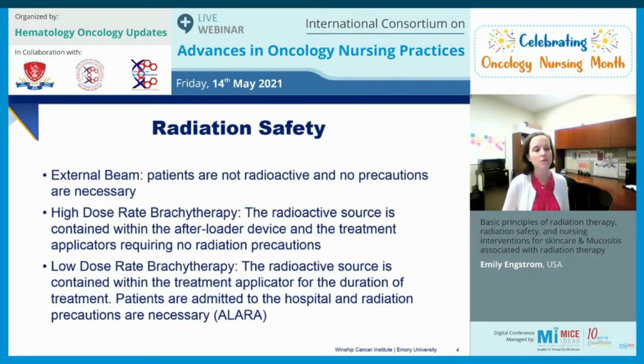And then we also used to use it very commonly for GYN cancers. We would admit our female patients to the hospital, and then place applicators where they needed to be, and then place those radioactive seeds in those applicators. Patient would stay in the hospital for a few days based on the dose.